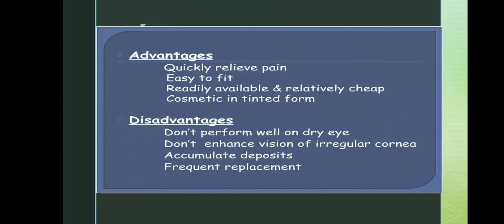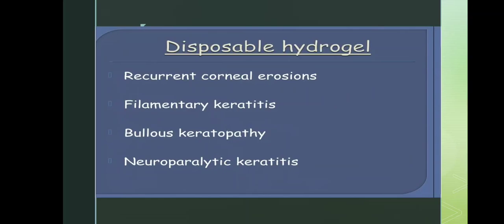The advantages: they quickly relieve pain, they are easy to fit, they are readily available and relatively cheap, and cosmetically useful in the tinted form. The disadvantages are they don't perform well on the dry eye, they don't enhance the vision of an irregular cornea, they accumulate deposits, and they need frequent replacement.